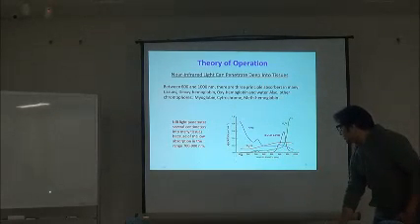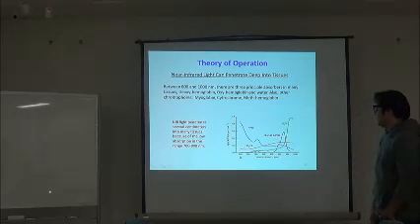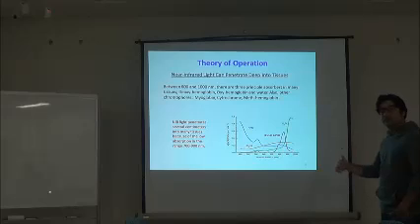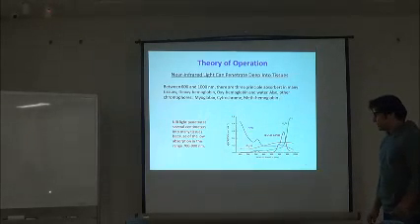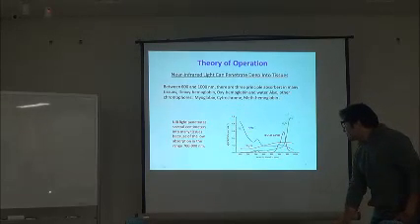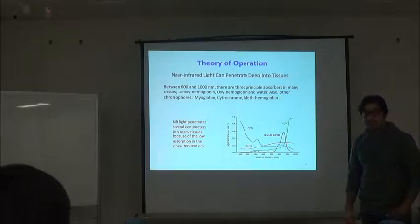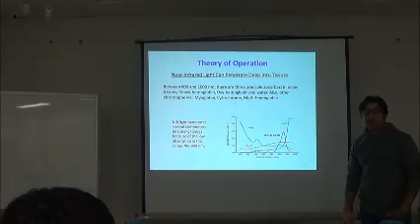Because in this region of the electromagnetic spectrum, the light absorption by different chromophores present in the blood is something like this. There is oxyhemoglobin, deoxyhemoglobin, bulk lipids, and water. The water absorption in this range is quite low. We want this because water does not give us any useful information, and 83% of our body consists of water.